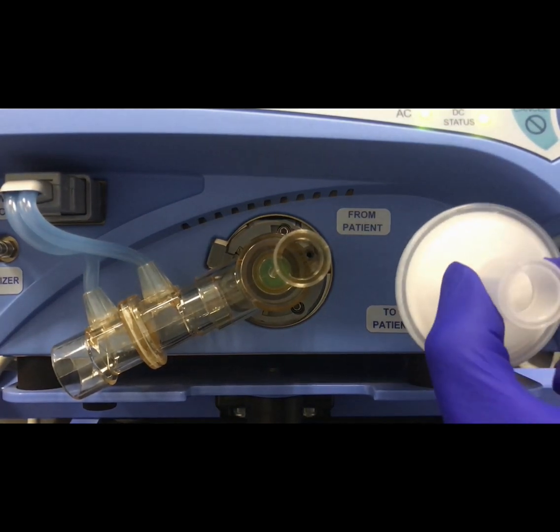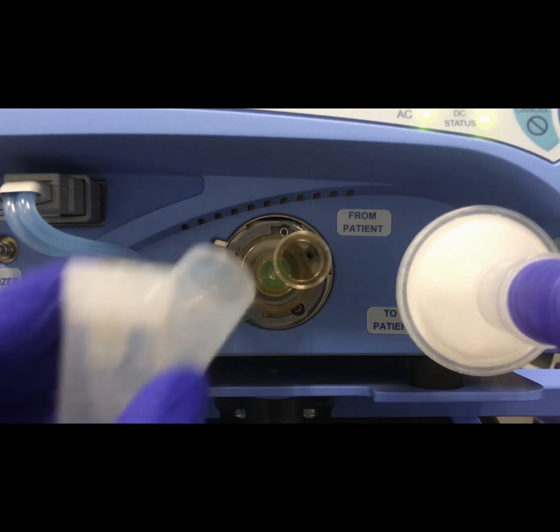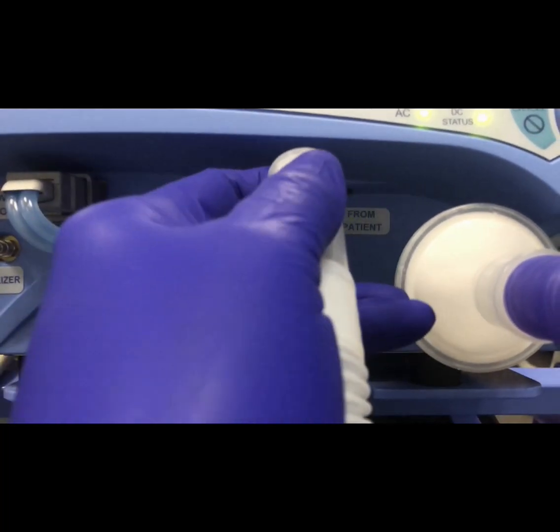Finally, we'll attach the breathing circuit, beginning with the inspiratory filter, then the inspiratory limb of the circuit, and finally the expiratory limb of the circuit to the exhalation valve body.